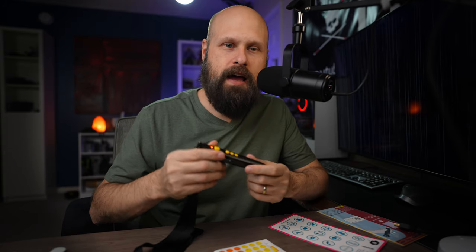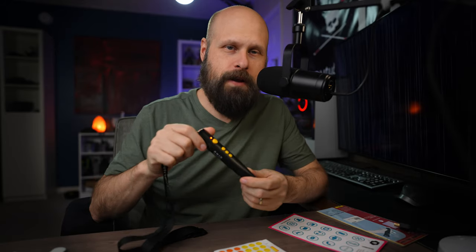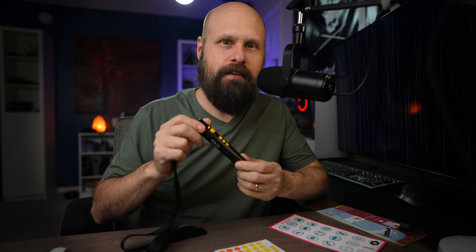If you already have a Pen Friend Generation 1 or Generation 2, the Generation 3 can read those old labels, but you will need to download all that label information onto the new Pen Friend Version 3. Luckily, there is another free software — the Pen Friend utility — that you can download to do that through a computer. On the side you have the USB port for connecting it to a computer and a headphone jack, so if you want to discreetly scan labels you can do that with a pair of headphones.